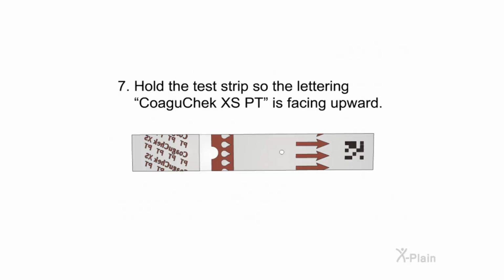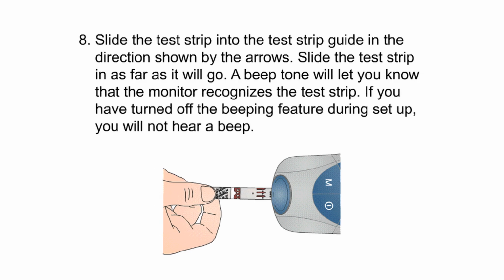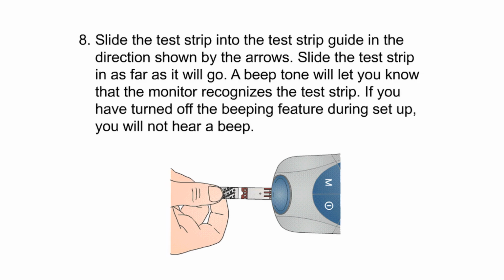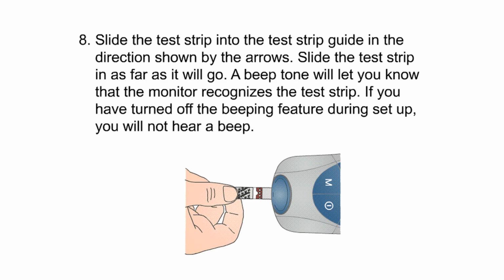7. Hold the test strip so the lettering CoaguChek XS PT is facing upward. 8. Slide the test strip into the test strip guide in the direction shown by the arrows. Slide the test strip in as far as it will go. A beep tone will let you know that the monitor recognizes the test strip. If you have turned off the beeping feature during setup, you will not hear a beep.